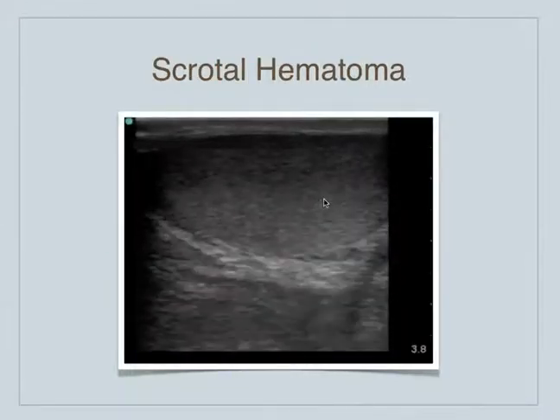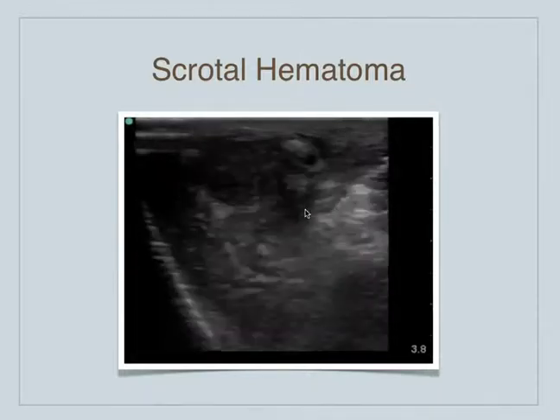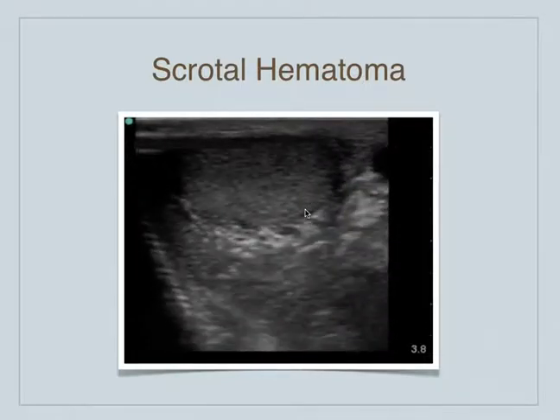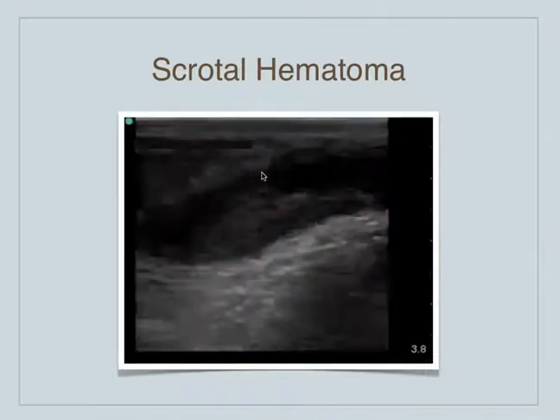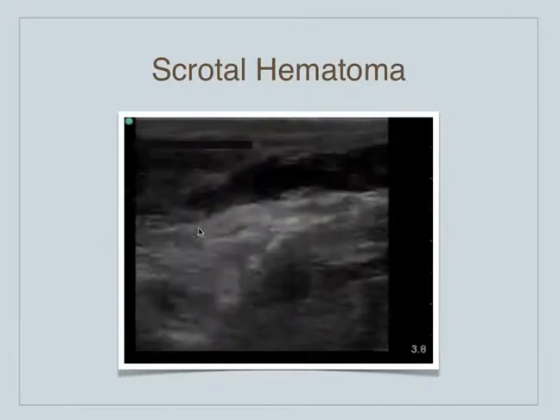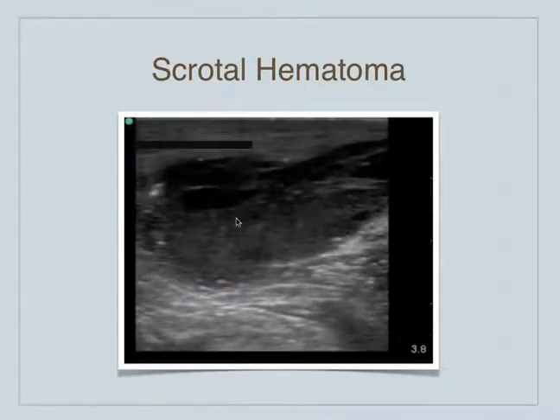This is another example of a scrotal hematoma. This is a normal-looking testicle; we're just fanning through it. As we get off to the edge, we're going to see a lot of hematoma adjacent to this testicle. This is all hematoma seen in this patient's scrotum from a severe blow — resulting in a lot of hematoma. Parts of it are not congealed yet so it looks more anechoic; parts of it are echogenic.